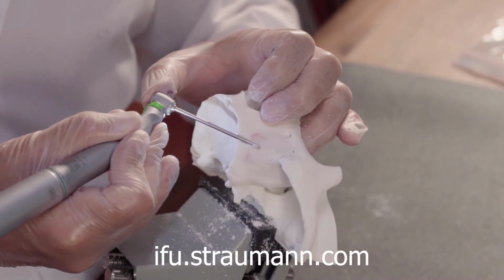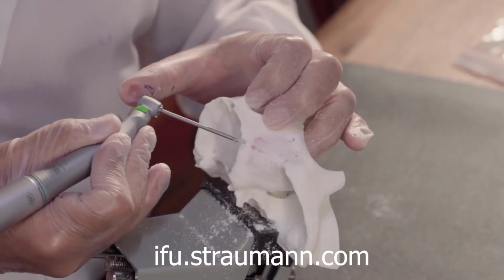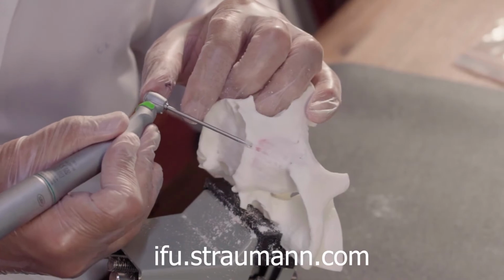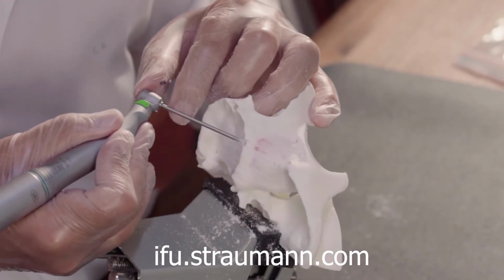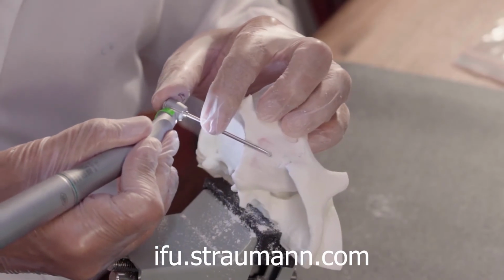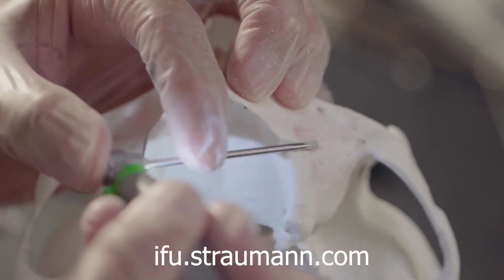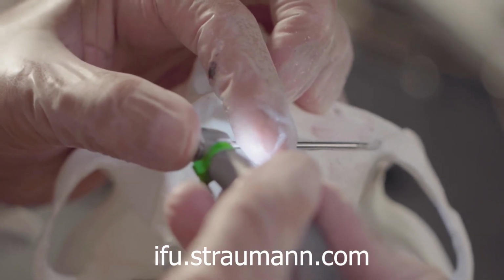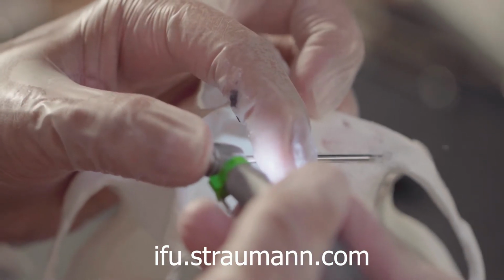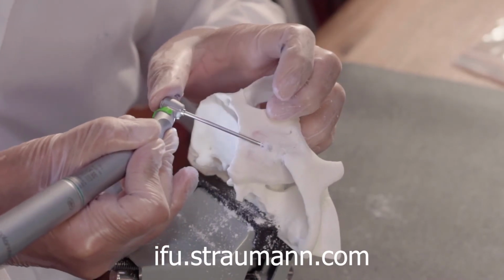Try to make a path as flat as possible, and you see we are getting like 5-6 millimeters of intact bone over here, and still the membrane is not being perforated, so still we can go a little bit deeper. The deeper we go, the higher the implant is going to be, the less compression we'll get on the soft tissue. 1, 2, 3, 4. We already have the notch.